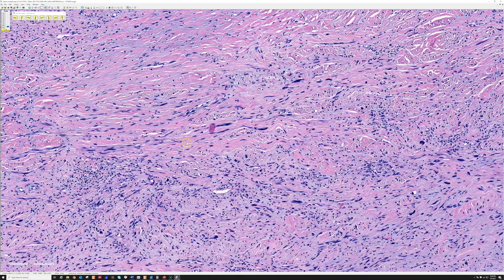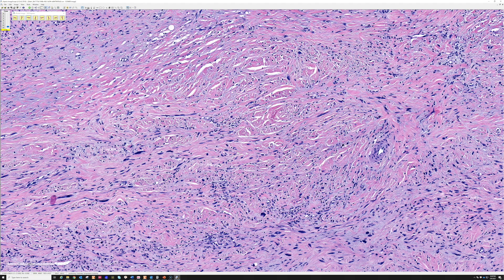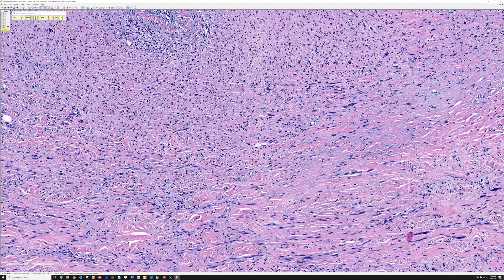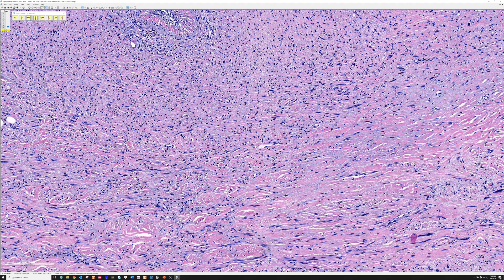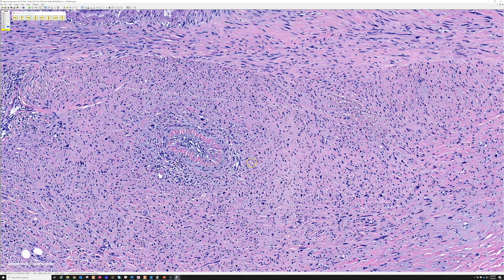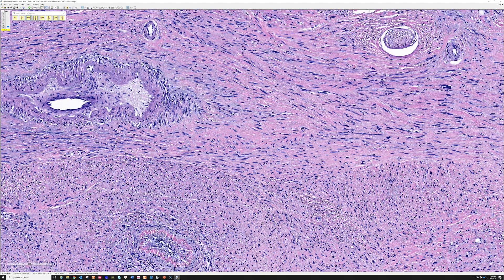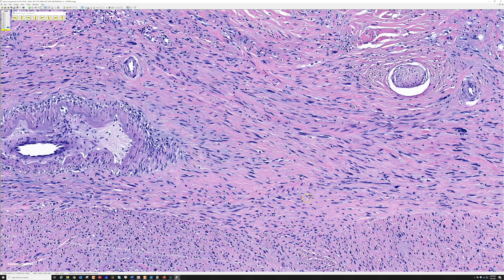They can look quite neural, and the problem is they stain very similarly to neural tumors - predominantly with SOX10 and S100 only. The ones that look most neural usually just stain with S100 and SOX10, exactly like a neurofibroma might. MART-1 (also called Melan-A) and HMB-45 are often negative. The vast majority of pure desmoplastic melanomas will be totally negative for those markers. If there is a component of more epithelioid melanoma, those areas tend to stain with the more specific melanocytic markers.